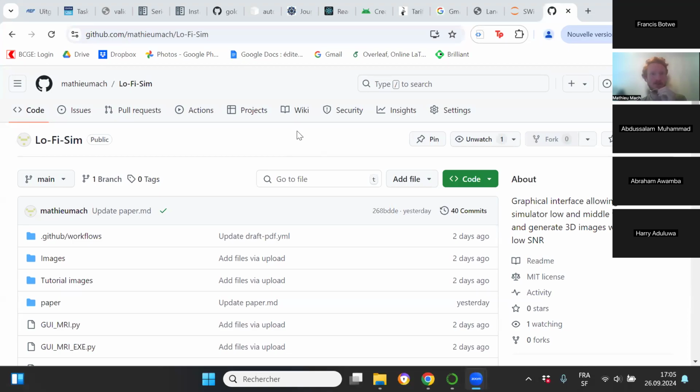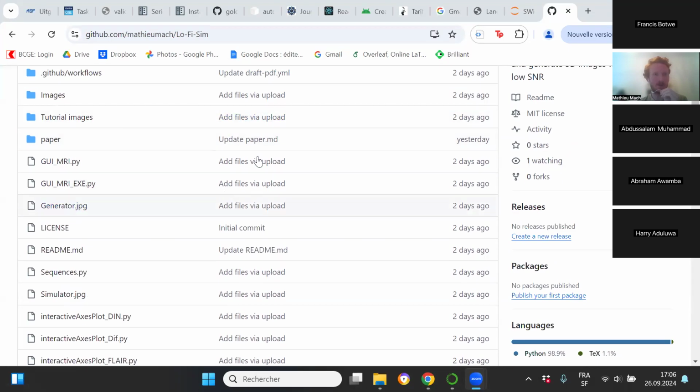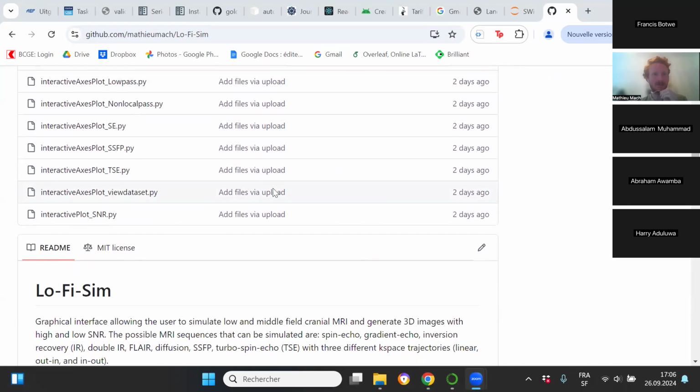There is still room for improvement, and if you have any feedback at the end of this session, I will gladly take it in. So yeah, work in progress, but everything can be found here.